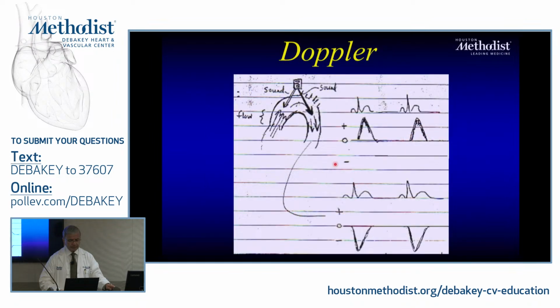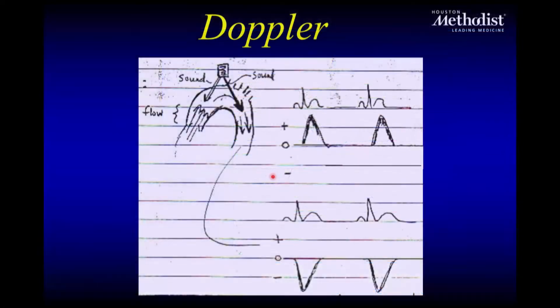Now, some of these effects you could see. I left this picture here. This is a historical picture, handwritten by Quinones. I left it there probably about 20, 25 years ago when he used to give this lecture. What you see there is that the frequency shift will tell me about direction. So if I'm looking at the aorta, for example, and I look at that frequency there, the velocity is coming towards me, so it's positive, and if it's going away, it's negative.